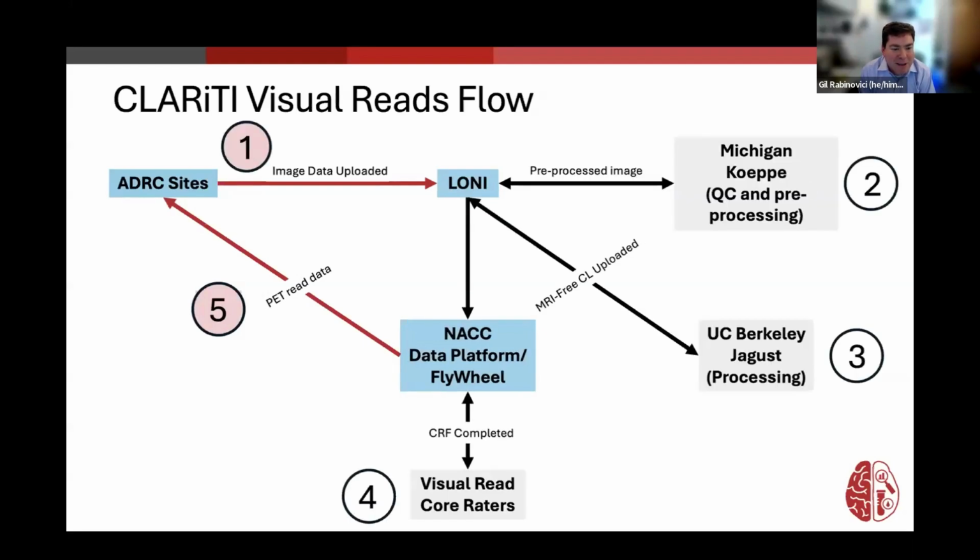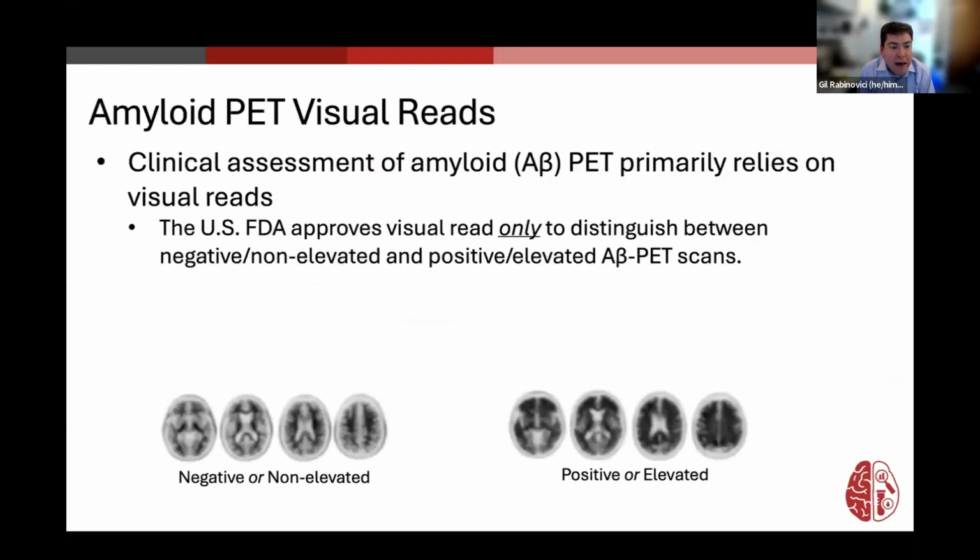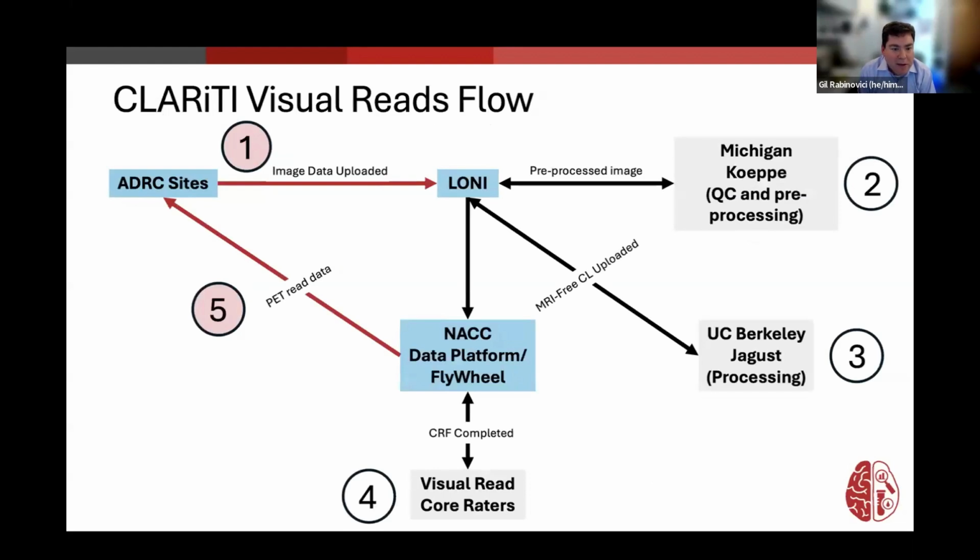It looks very complicated, multiple stops, but hopefully this leverages the SCAN data pipeline and also will get you the results that you need. Currently, we're committed to giving you results within 90 days of when the scan is uploaded. Hopefully, we can do it on an even tighter timeline, but just as we're sort of testing the process, 90 days is what you can expect.